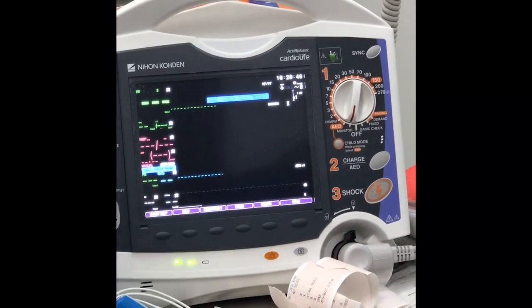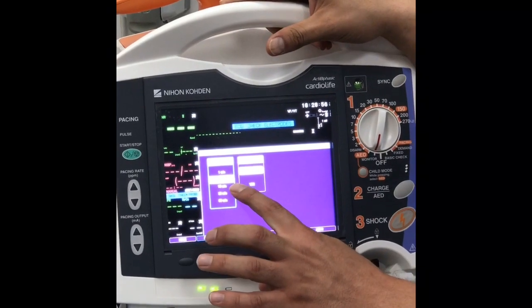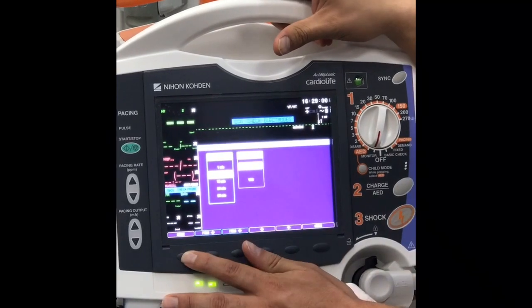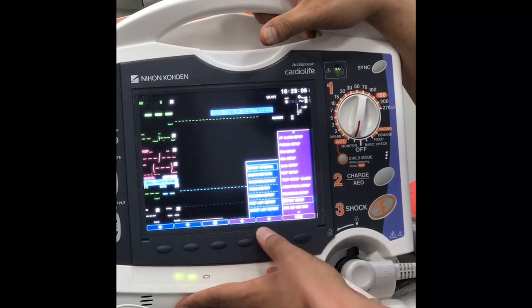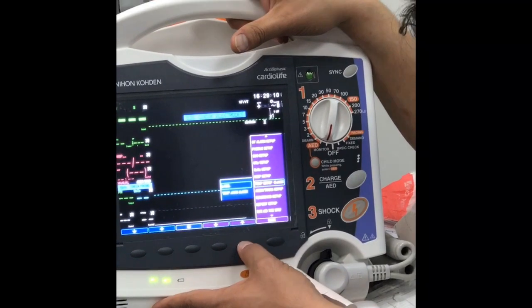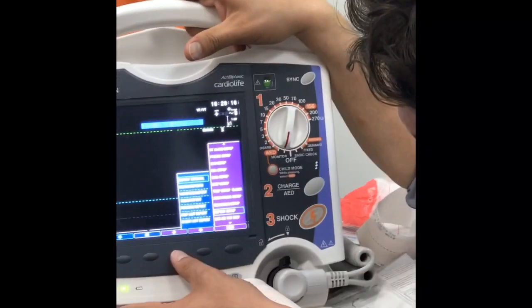There is no pop-up trend. Where is the trend in the blue? Trend report, yeah, this one. We need that one. That's very important to us, the trend report. This is every hour. I want to reduce this one to every 10 minutes, 5 minutes. 1 hour.